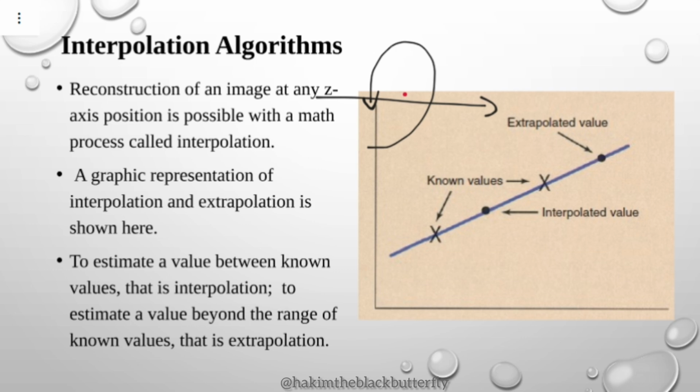Those bits of anatomy can be reproduced mathematically. That information that is not in the scan data can be estimated using mathematics. We call that interpolation or extrapolation.